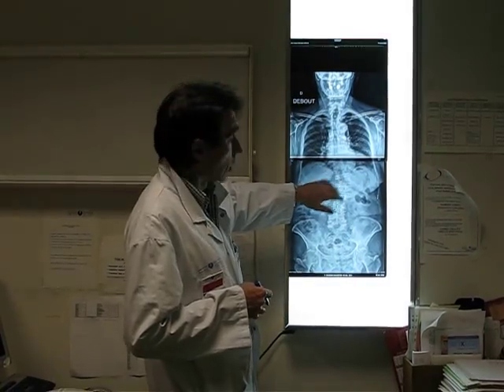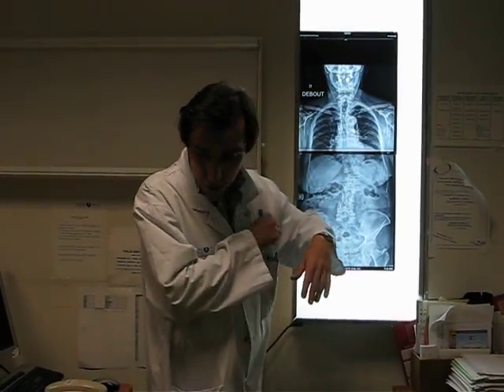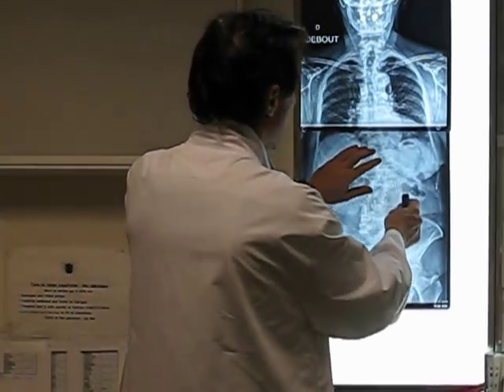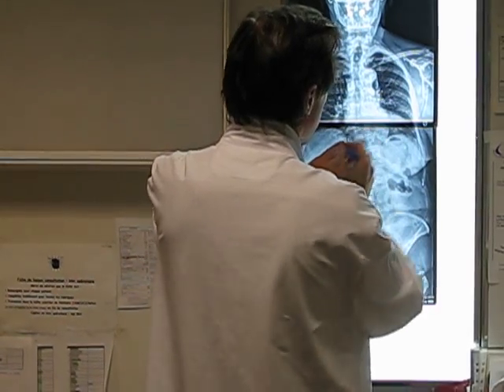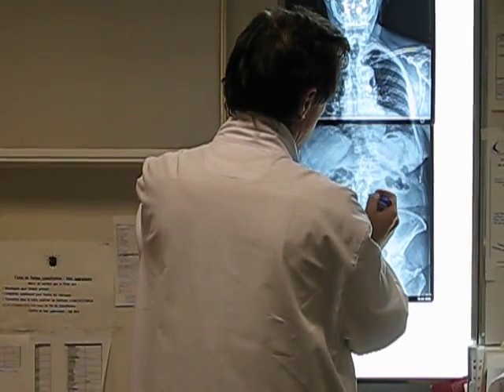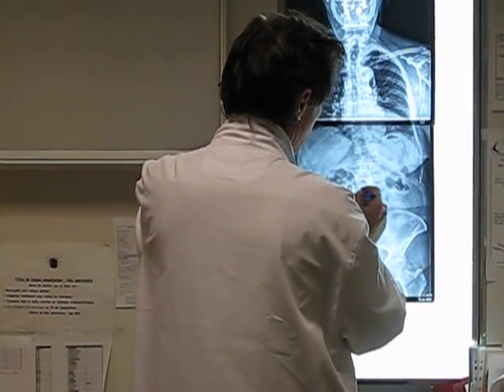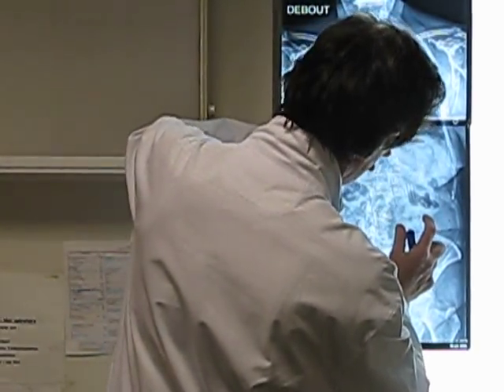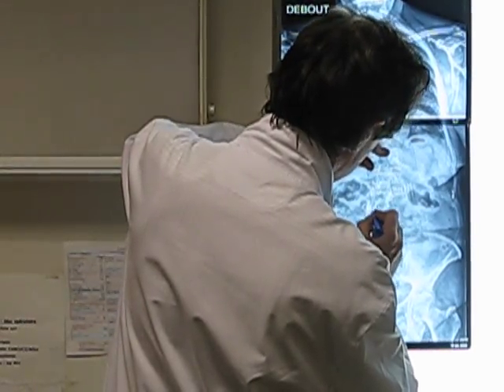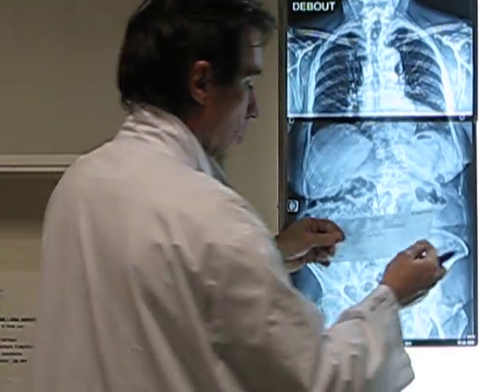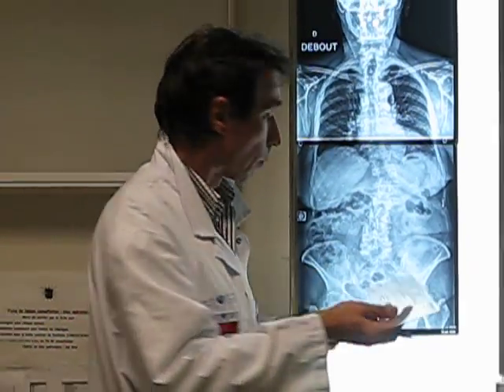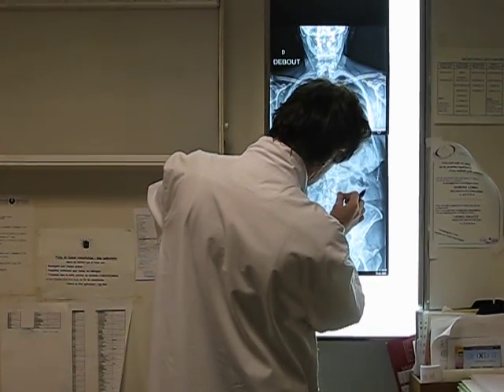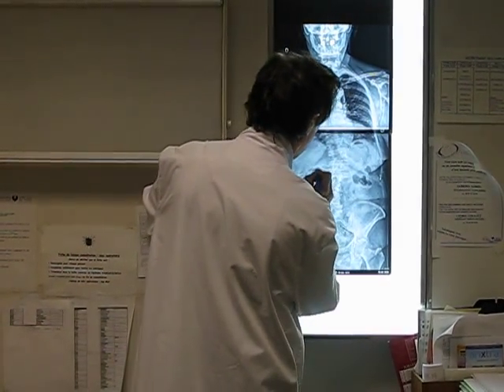The way we usually measure the angle of scoliosis is by drawing a line on the upper end plate of the upper limit vertebra and the lower end plate of the lower limit vertebra. Then you draw the angle and measure with this goniometer which you have in your pocket, and you measure here and find it — that's 30 degrees.